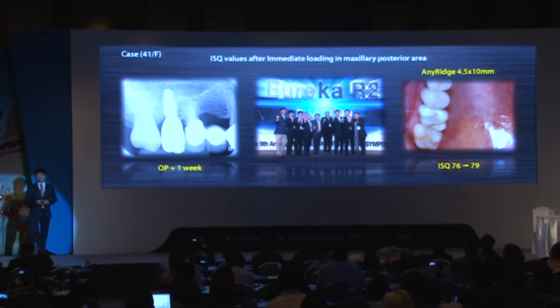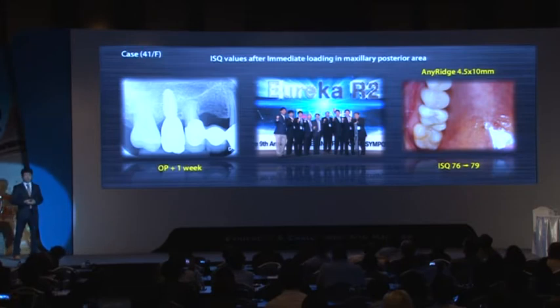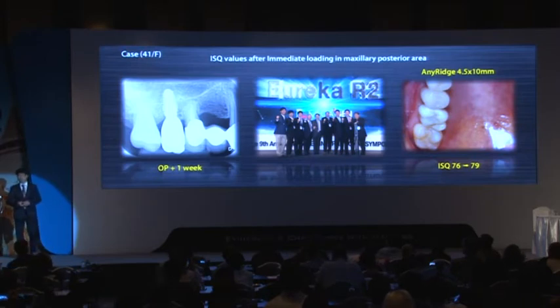By that time, Dr. Kim was asking me a question. Hey, Dr. Han, we knew the ISQ values of Anyridge in an unloaded situation. Then, what about the ISQ value of Anyridge in a loaded situation? I answered, I don't know that, but I can figure it out. To answer this question, I decided to unscrew the final prosthesis and measure the ISQ value at an interval of 1 week.